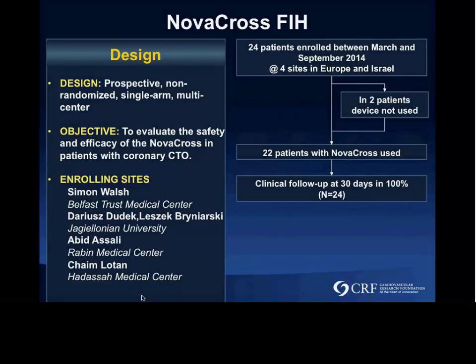It was done by four European centers, two in Israel, one in Belfast, Simon Walsh, and our center in Jagiellonian University. So finally, we enrolled 24 patients in the period between March and September 2014. And in 22 patients, NovaCross was used. And clinical follow-up up to 30 days was obtained in 100% of the patients.